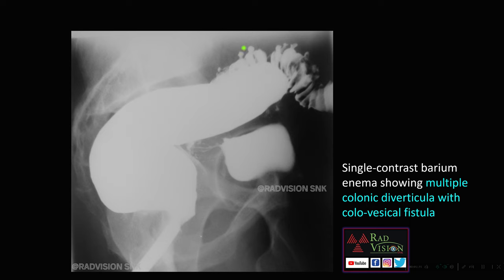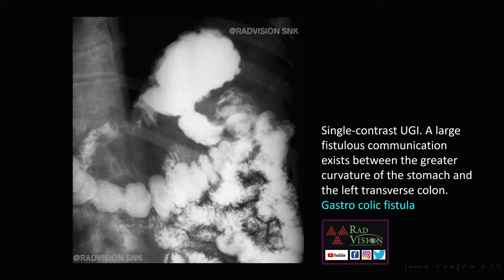Here you can see a single contrast barium enema with multiple colonic diverticulae. While doing the barium enema, you should not see contrast in the bladder. Because of an abnormal fistulous tract or communication between the colon and the bladder, contrast is visible in the bladder during the barium enema. This was a case of multiple colonic diverticulosis with colovesical fistula.